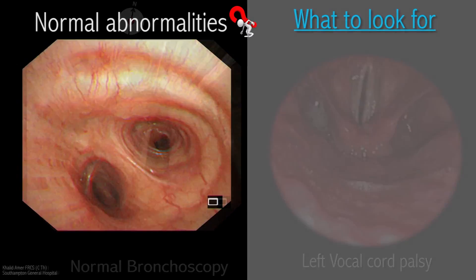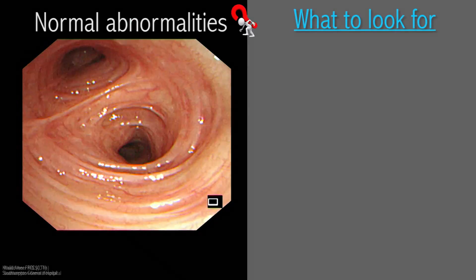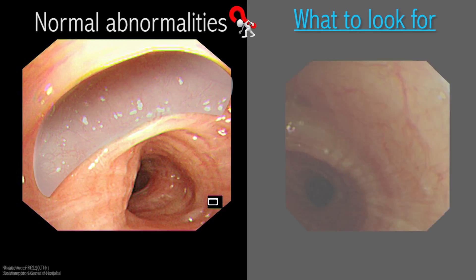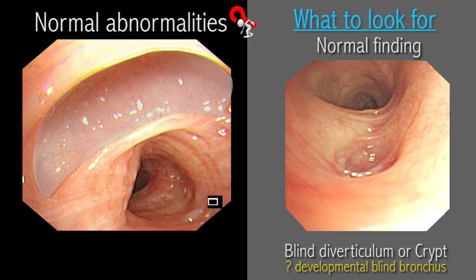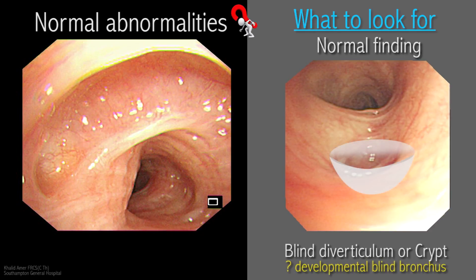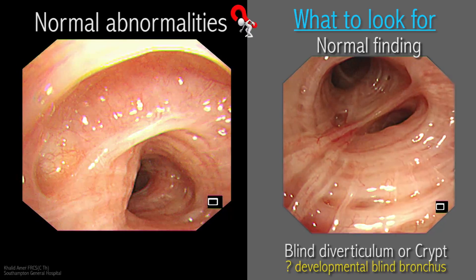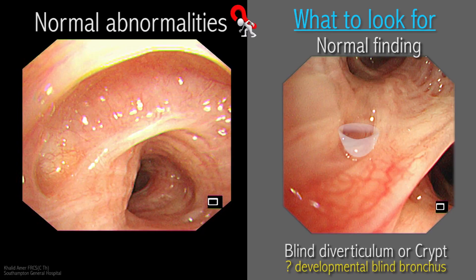The normal-looking bronchial mucosa is sometimes seen to be interrupted by small crypts and diverticulae, which vary in shape and length. These crypts represent arrested development or blind ends of bronchi that did not proceed to full-length development. This is a normal finding, does not merit reporting, and should not be confused with a fistula track.